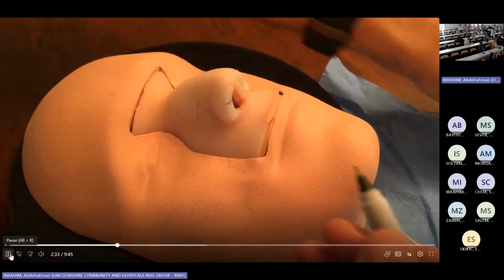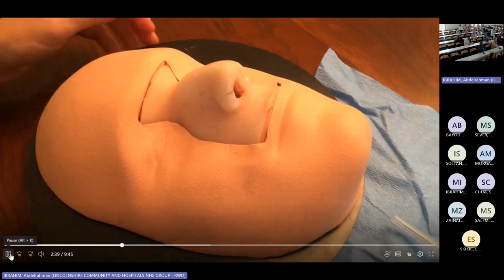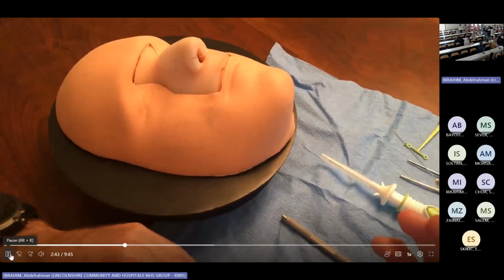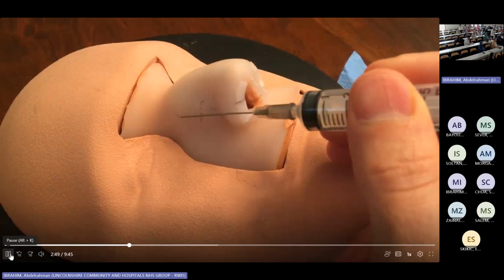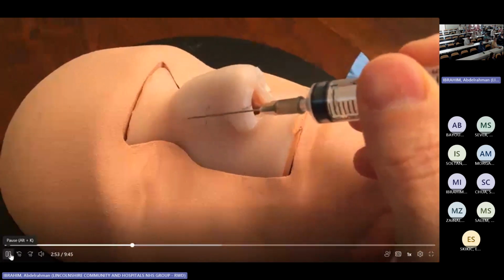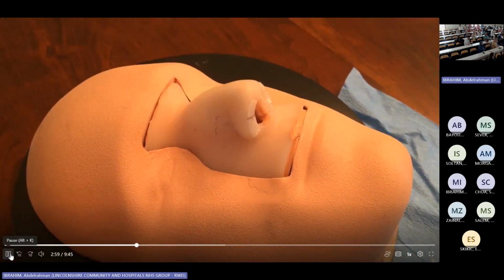From there, I'll put down the positioning guide and marking pen. Now we're going to want to inject. So I will take my injection syringe with my lidocaine epinephrine. I will inject up the track to my distal mark with a 27 gauge needle and inject 0.5 cc as I withdraw through the track. Perfect.